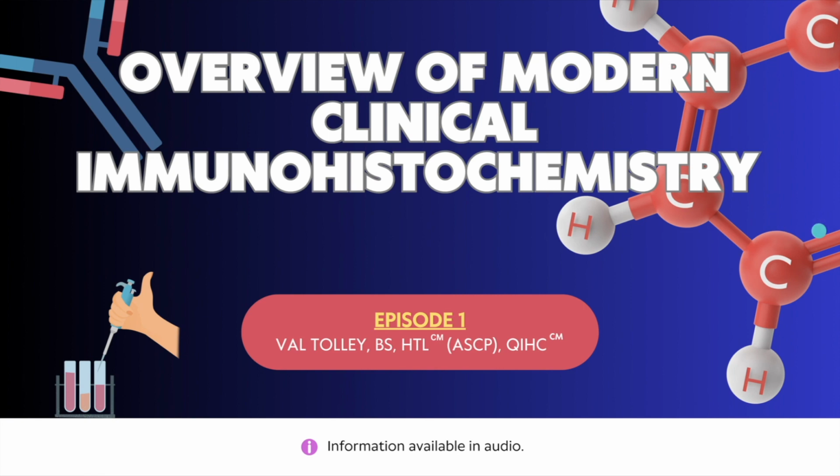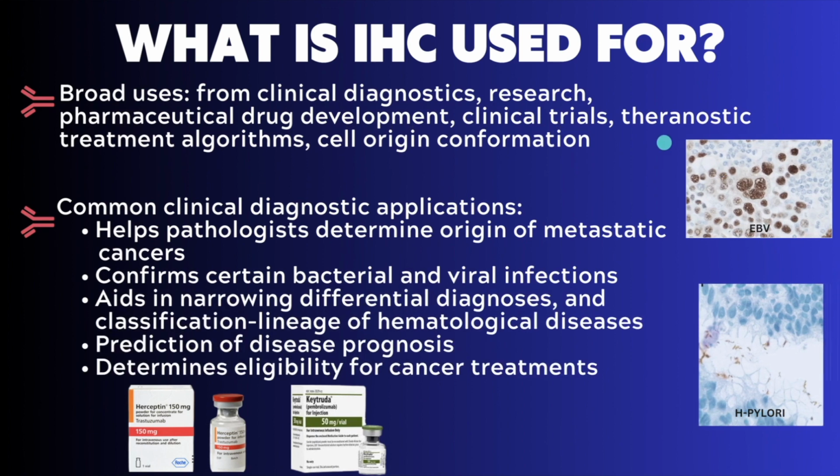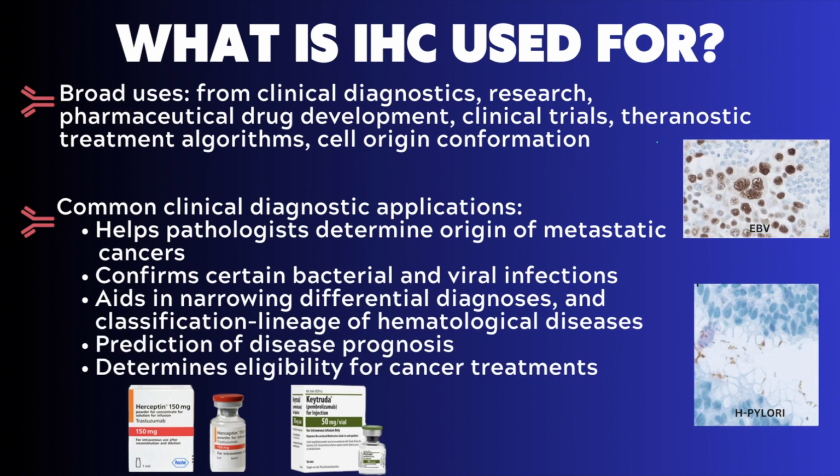What are common uses of IHC? IHC has many useful applications such as clinical diagnostics, academic research, pharmaceutical drug development, and more. For this series, I am choosing to mainly focus on the clinical application of IHC. For clinical pathologists, IHC is just one tool in their tool belt of diagnostics. IHC can help determine the origin of a metastatic tumor. It can also confirm certain viral and bacterial infections. I have a couple examples off to the right of the screen.